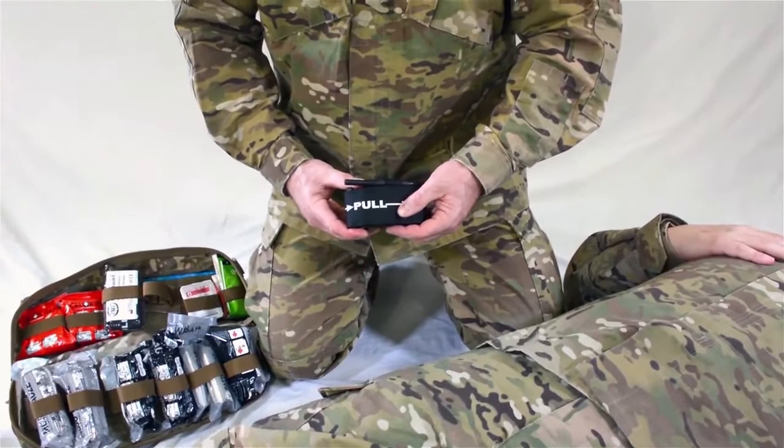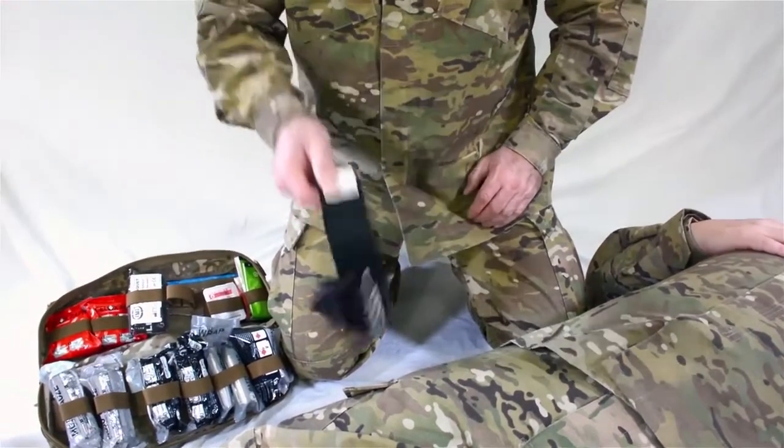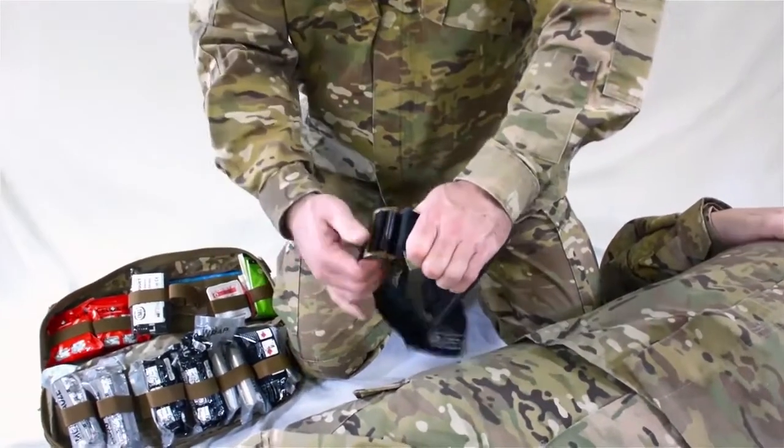Hold the end of the strap by the white time label tab. Allow the TMT to fall open. Grab the TMT by the buckle and separate the two sections.